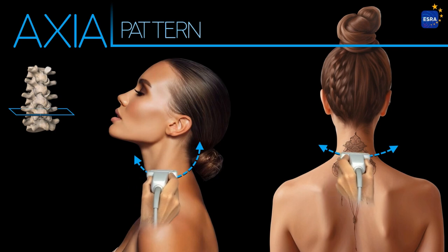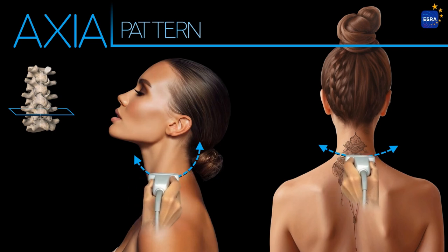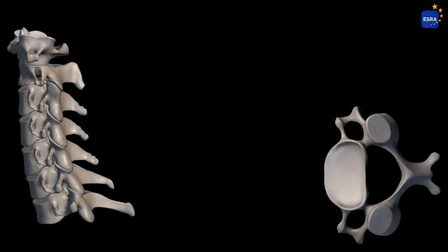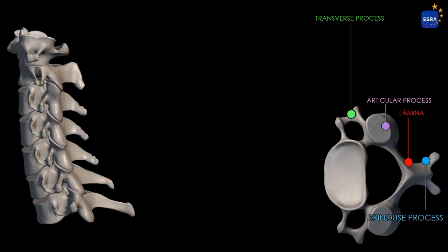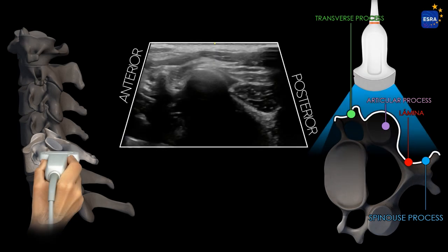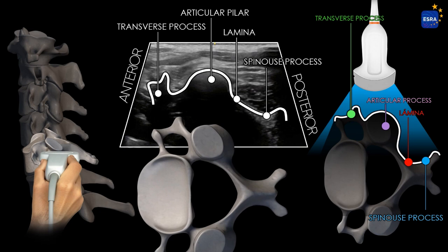For the acquisition of axial plane images, the transducer is positioned in a lateral axial orientation placed over the midpoint of the neck, typically corresponding to the C4 to C5 vertebral level. This anatomical location serves as the recommended starting point for any ultrasound scanning. At this level, the anterior pillar is visualized, formed by the transverse processes and the nerve roots corresponding to each spinal level. The articular pillar is identified in the most lateral aspect, while the posterior vertebral arch is delineated by the laminae and spinous processes.